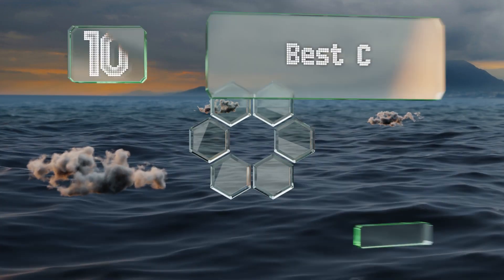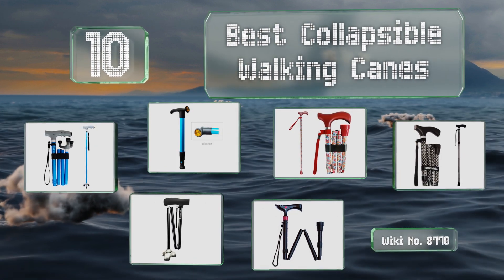EasyVid presents the 10 best collapsible walking canes. Let's get started with the list.